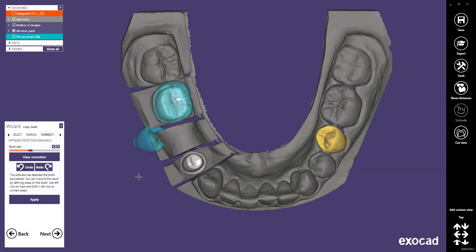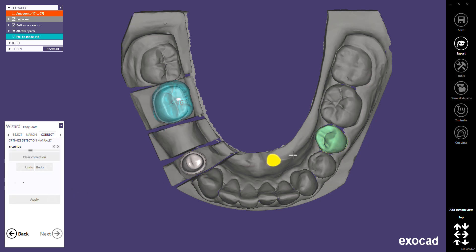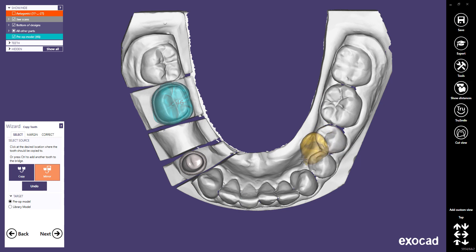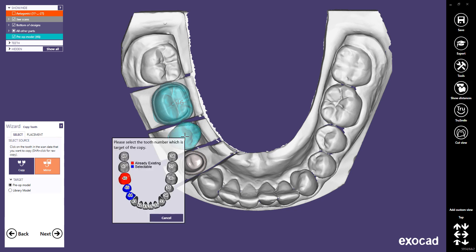Click Apply to apply your changes to the tooth. Then position the tooth and set it with a click. For Pontics, you will be prompted to select the target tooth of your tooth copy.